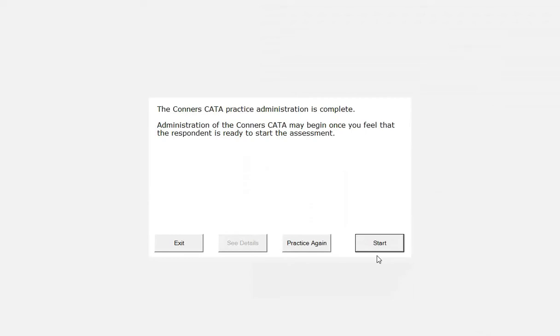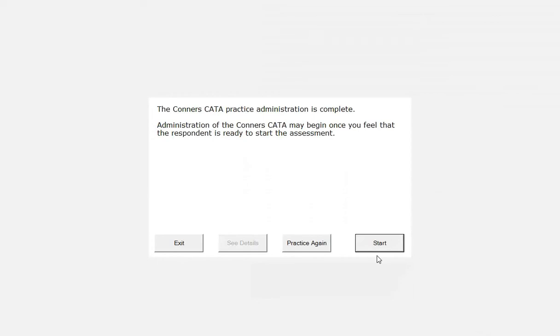Keep in mind, high error rates could be due to clinical impairment or an inability to understand the task, and it is up to the administrator to decide which explanation is the more likely reason. If the high error rates are caused by clinical impairment, then the respondent should proceed to the actual administration. If the high error rates are thought to be related to the respondent's inability to understand the task, then consider forgoing the actual administration after three failed attempts at the practice test. Once the decision has been made to start the actual administration, ask the respondent to refrain from asking any questions until the administration is complete.